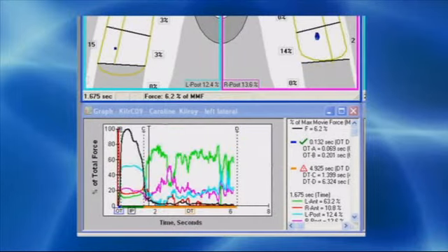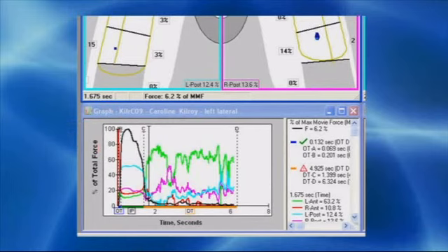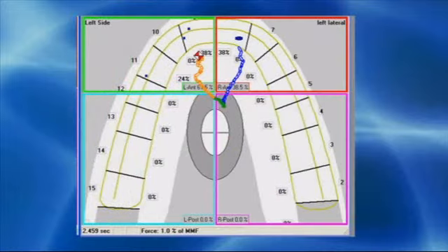If we place the timeline in the preoperative graph of movie number 9, 0.363 seconds to the right of the C line, we can compare the amount of tooth contact that's present in both excursions after 0.363 seconds. In the two-dimensional plot above the graph of movie number 9, you can see that tooth number 15, 14, and 12 and tooth number 2 are still in contact after 0.363 seconds has passed. Whereas postoperatively, after 0.363 seconds has passed, there's no posterior teeth in contact at all.